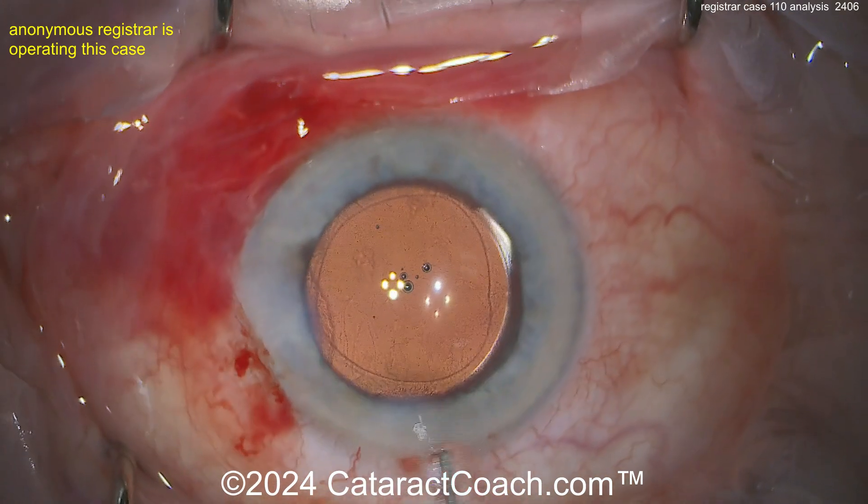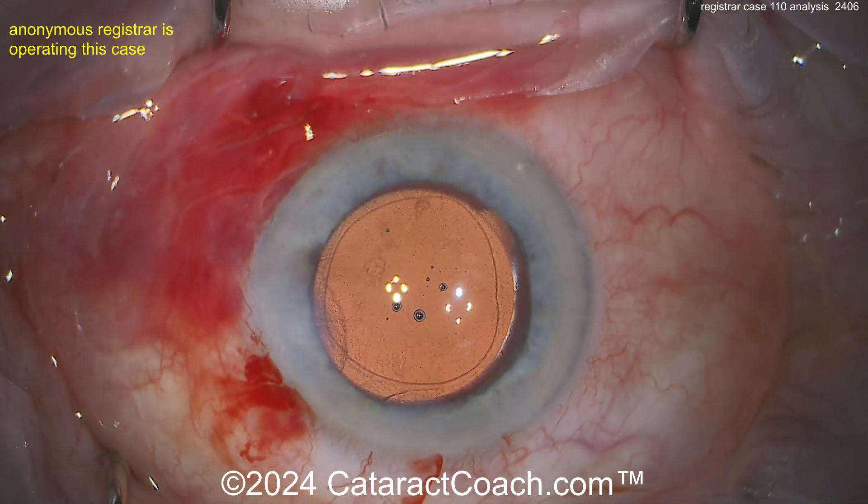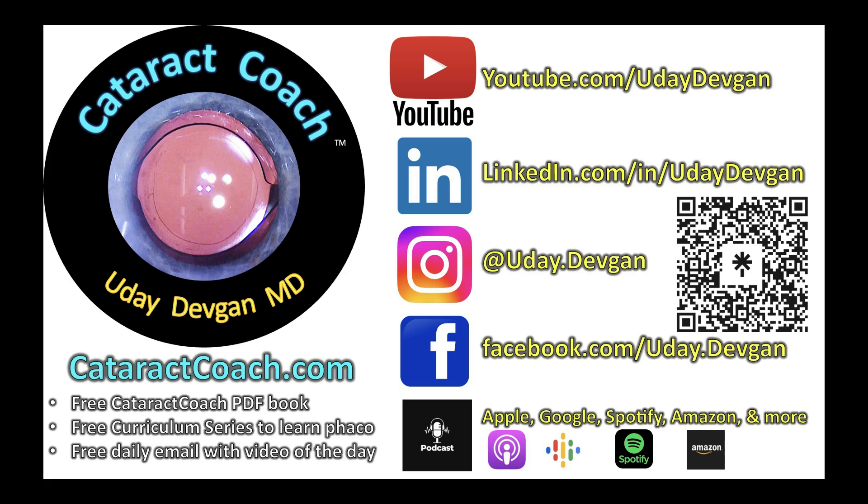Another hint: you don't need all that trypan blue — what do you need it for? A little bit here on the roof of the incision — do it the CataractCoach style. There it is — good job! Remember to check out all the resident materials on CataractCoach.com.